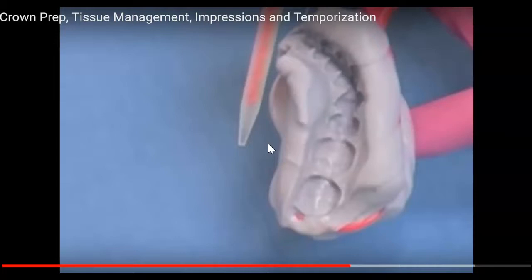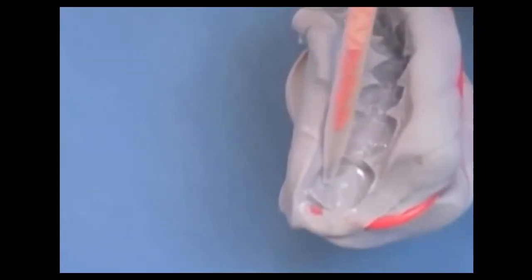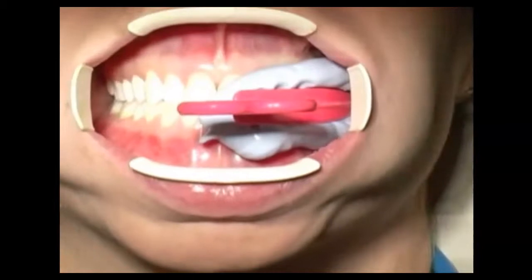that they took. This is going to be using an acrylic type of material, and this is going to be a little bit more of a custom type of provisional or temporary. Okay, good. Yeah, just go all around the edges first. You want to make sure there's enough material dispensed that as you seat the tray, some of it's going to flow out to ensure that you're going to get everything that you need.